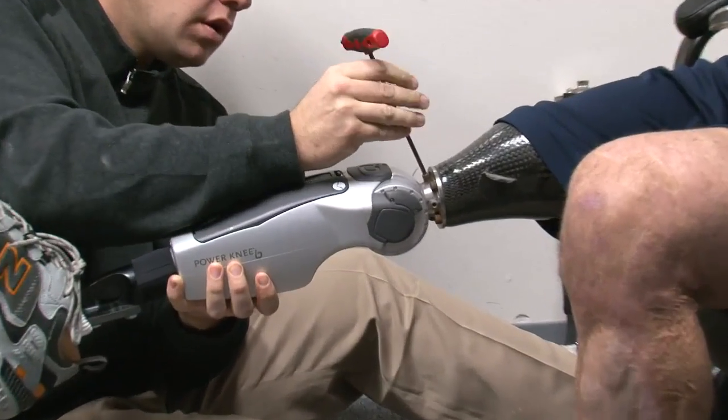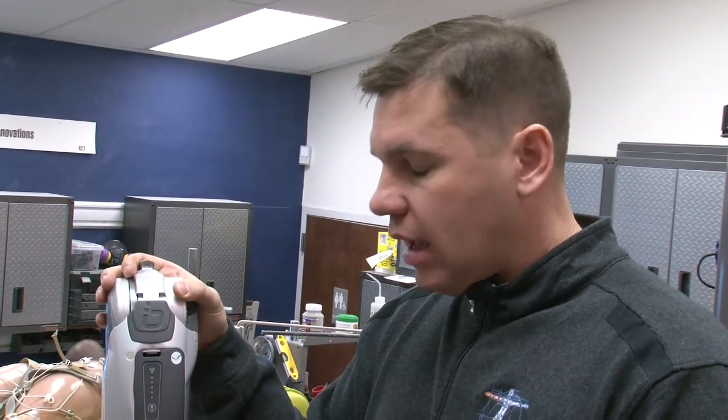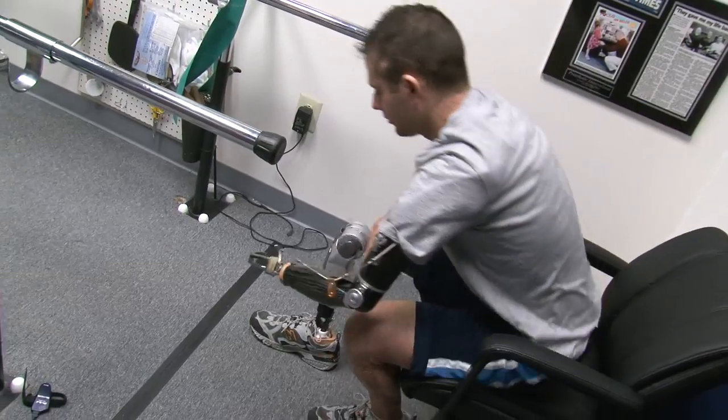One of the latest advancements in our profession has been the ability to provide power to a prosthetic limb. Individuals that come in and lose a segment of their body lose function, and for years we haven't been able to really restore that function. Most prosthetic limbs are passive in nature — it's a spring that the amputee loads and then it will restore some energy.